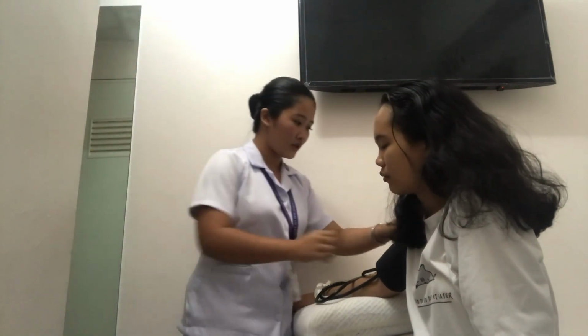So ma'am, I got your blood pressure and it's 115 over 75 millimeters of mercury, and it's within the normal range. Thank you so much for your cooperation, ma'am.